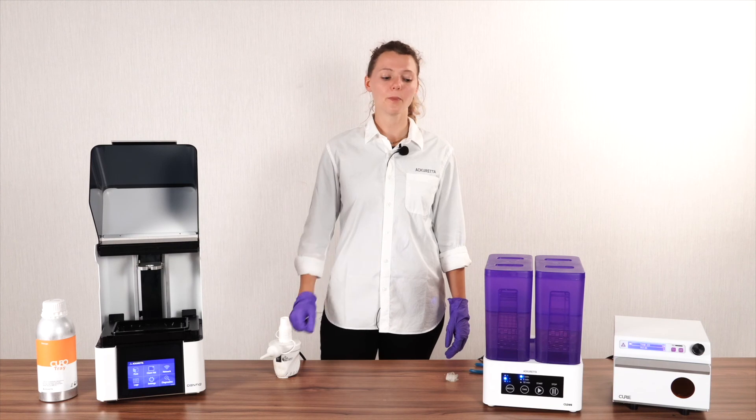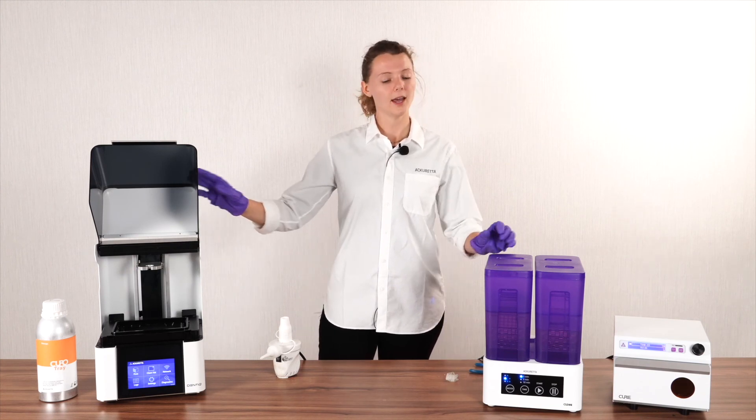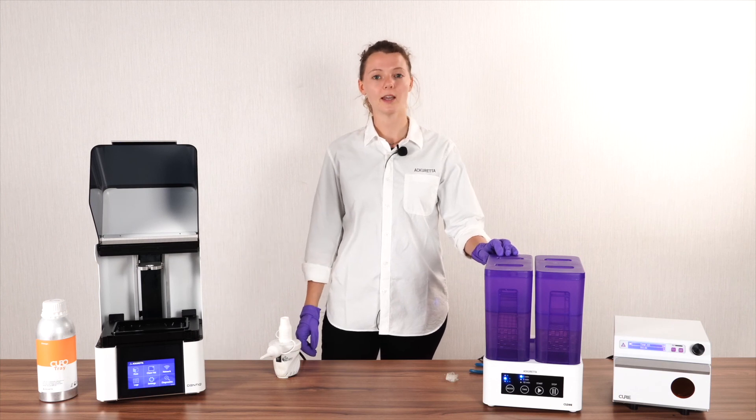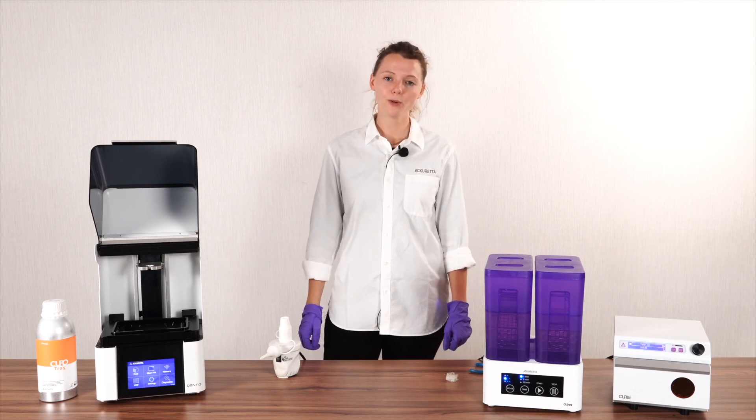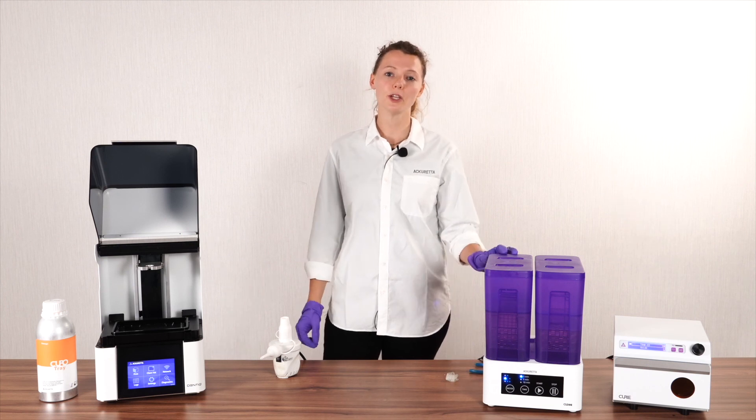This is the perfect example of a validated printing workflow. We finished our 3D print and used our post-processing equipment. Your dental application is now finally suitable for intraoral use.